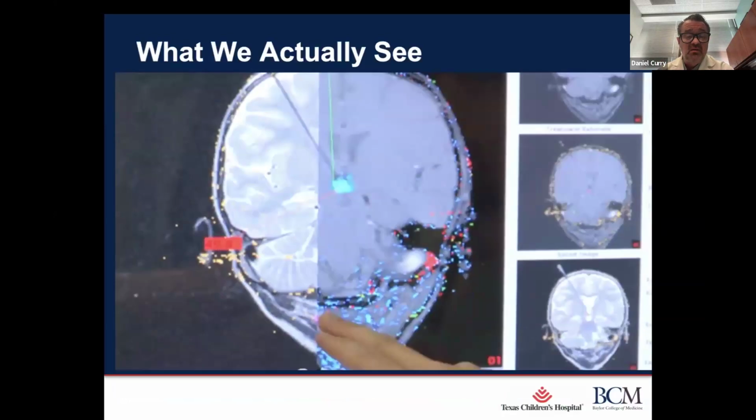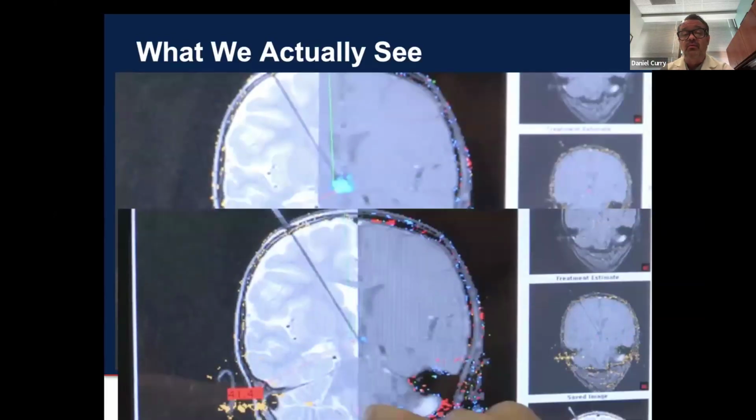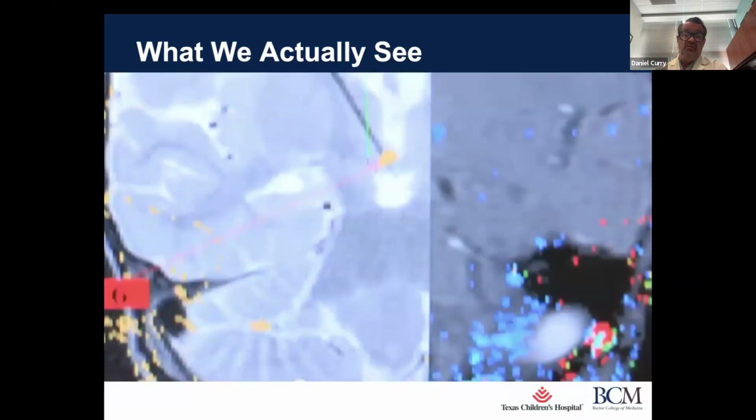So this is what we actually see during the operation. We split the anatomic scans on the left to the thermogram on the right, and we watch the lesion develop. This is an irreversible damage map handled by the software that tells us a certain pixel over a certain time is now destroyed, and I simply paint the lesion to its maximal with that thermogram. So that's the thermogram dosing that you can't do in RF.